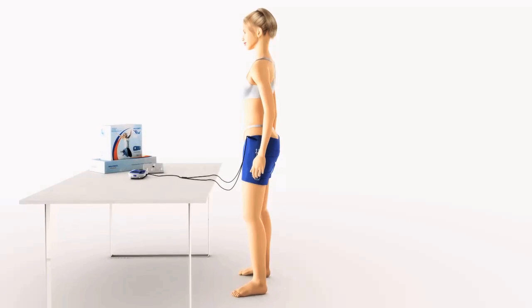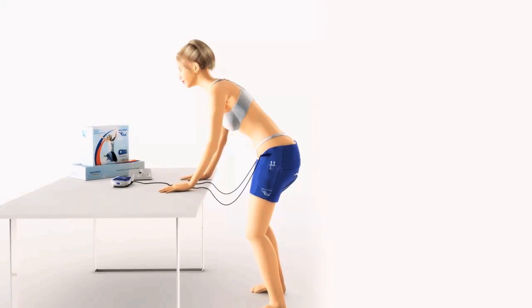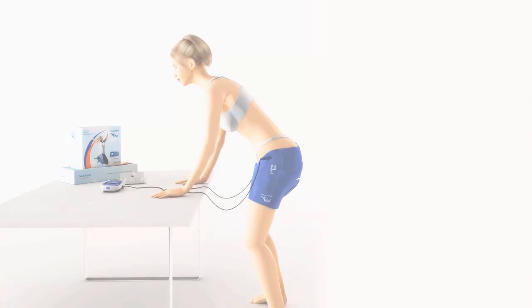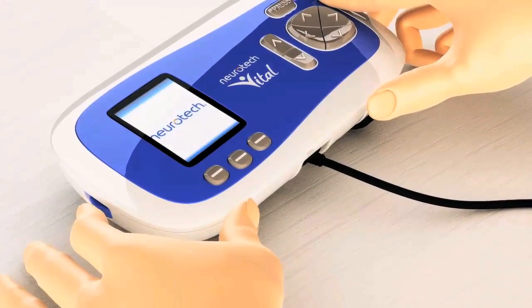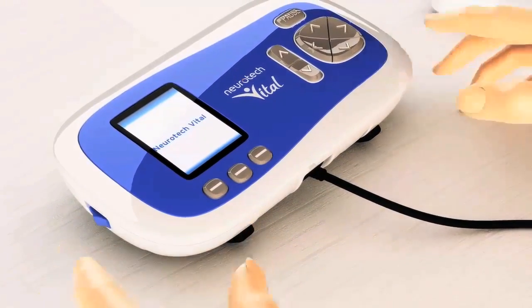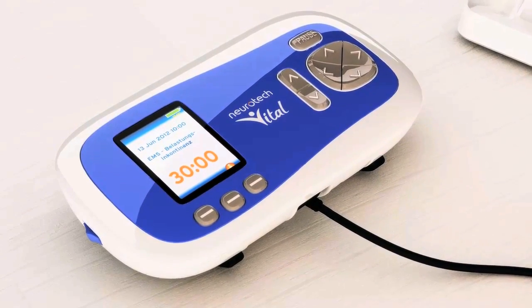During the treatment session we recommend that you stand leaning slightly forwards, supporting yourself on a table. Start your treatment session by switching on the Neurotech Vital controller. The display shows you which programme is set to run. This should be programme 1 for stress incontinence.